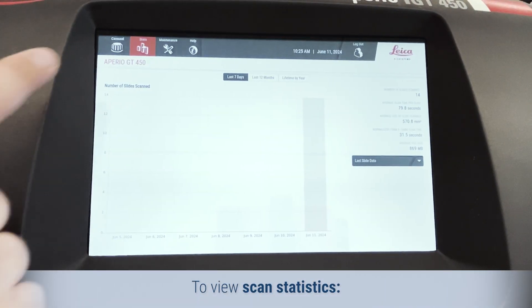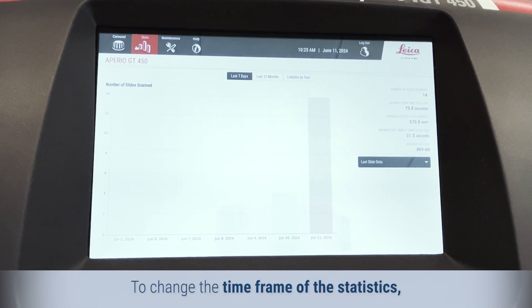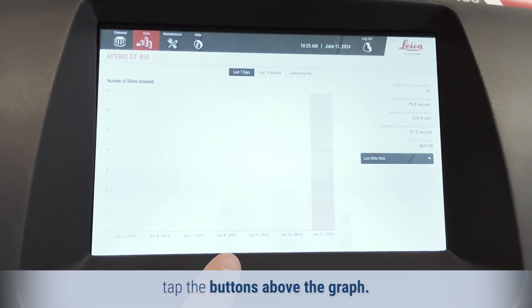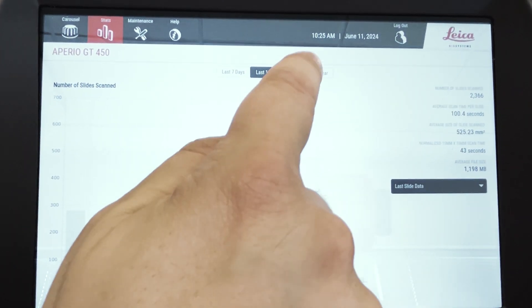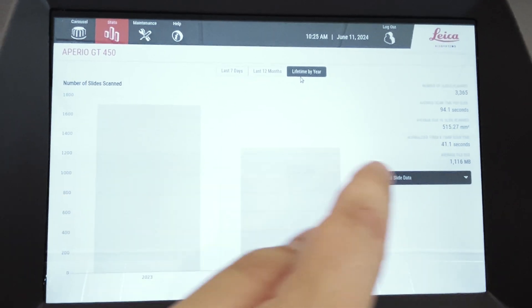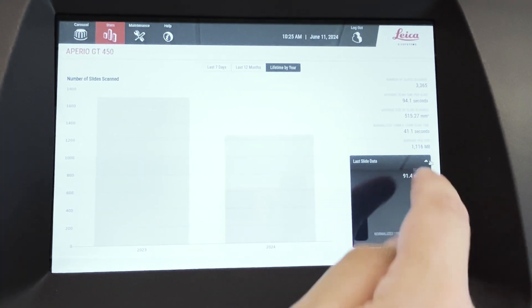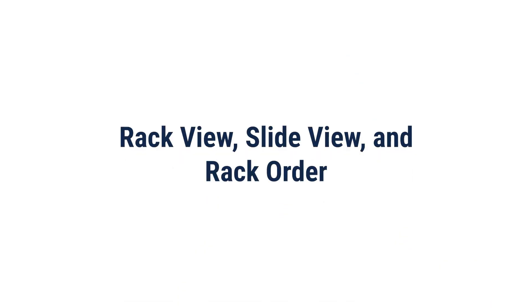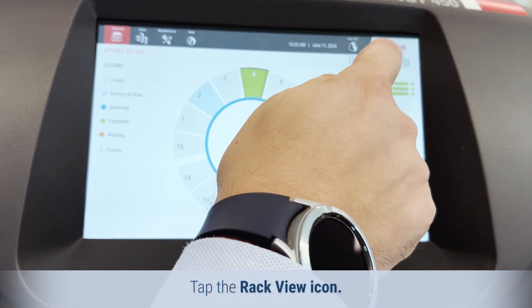To view scanned statistics, tap Stats. To change the time frame of the statistics, tap the buttons above the graph. To show the scan status for each slide in the rack, tap the Rack View icon.